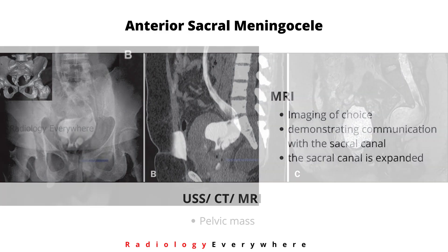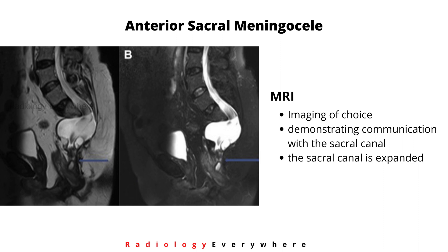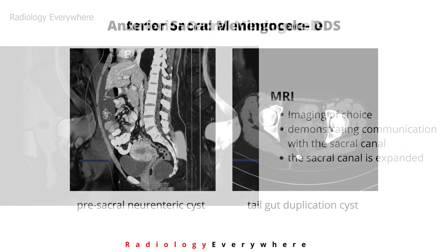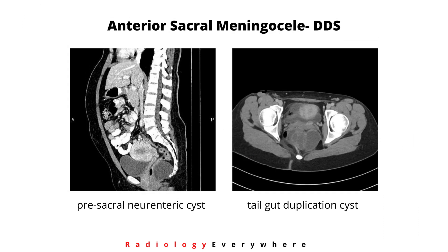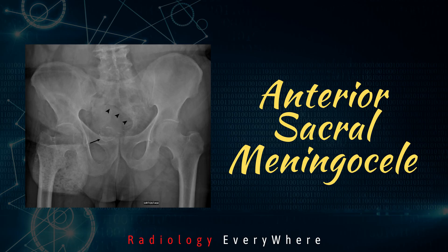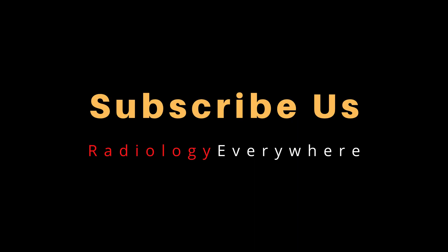On ultrasound, CT, and MRI you can see a pelvic mass. MRI is the imaging of choice and demonstrates communication between the lesion and the sacral canal. You can see the expanded sacral canal. Well-known differential diagnoses of anterior sacral meningocele are pre-sacral neuroenteric cyst and tailgut duplication cyst.